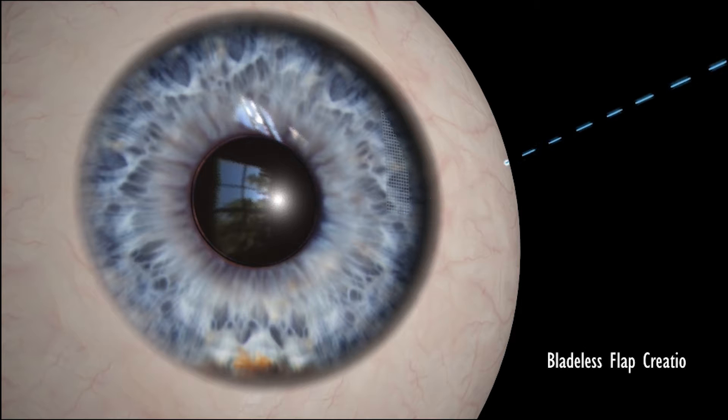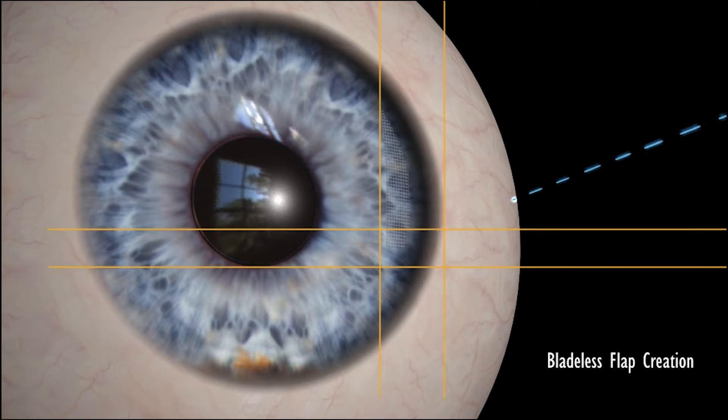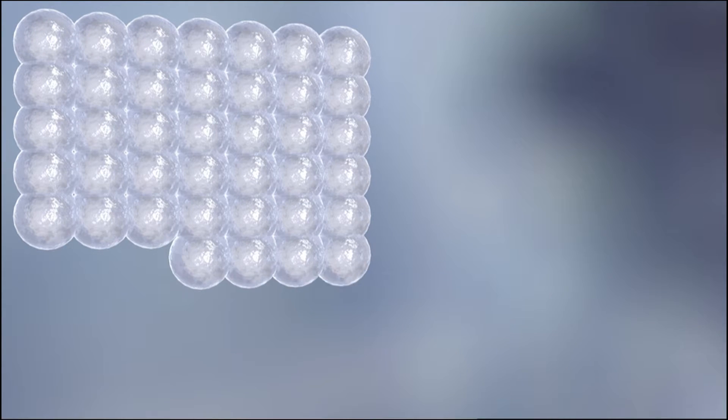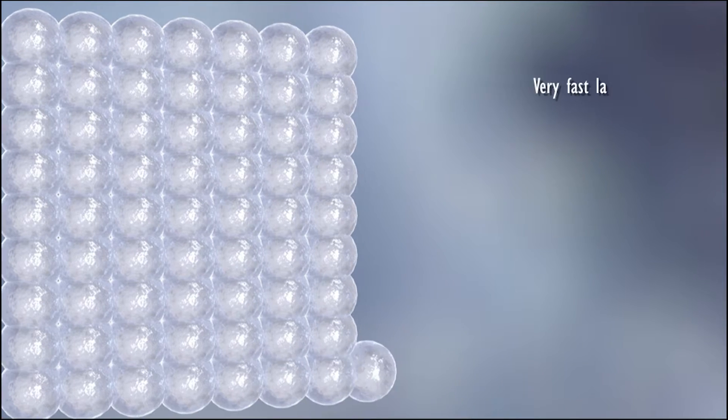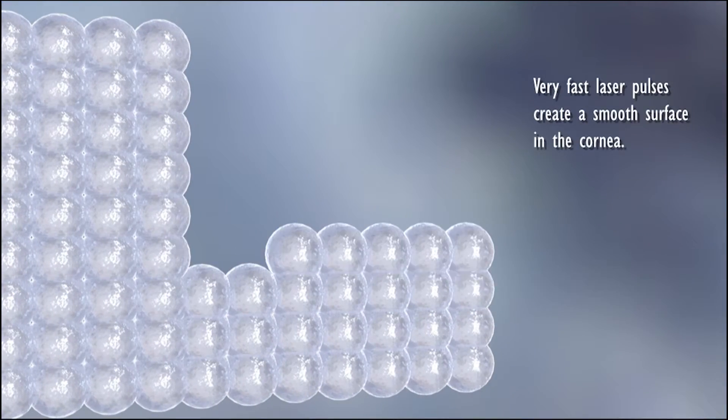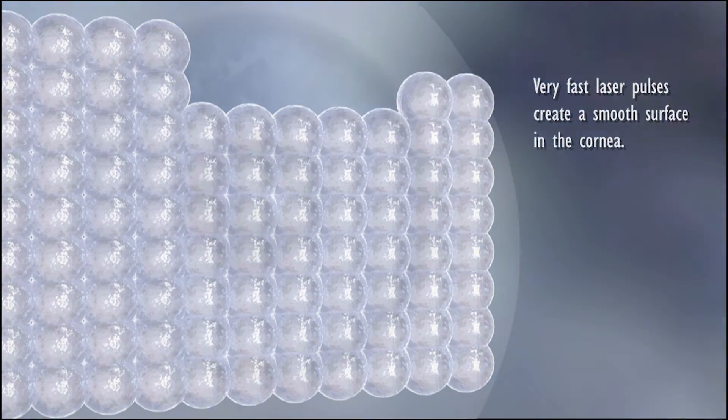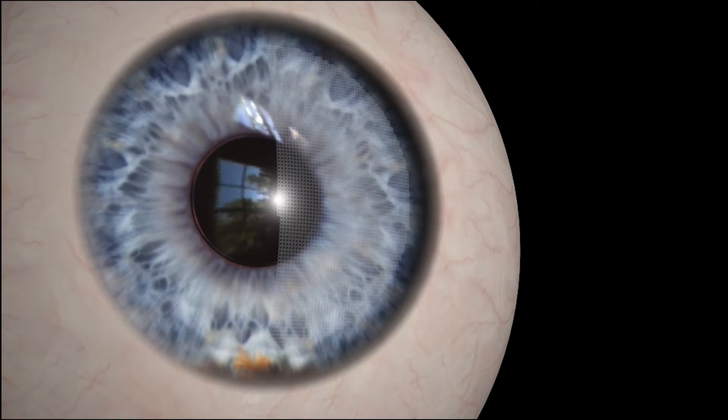Z LASIK is a two-step, bladeless procedure. With a femtolaser, your surgeon creates a thin flap on your cornea. With its extremely high frequency of pulses, the femtolaser separates the layers of the cornea in only a few seconds, creating an ultra-thin flap.